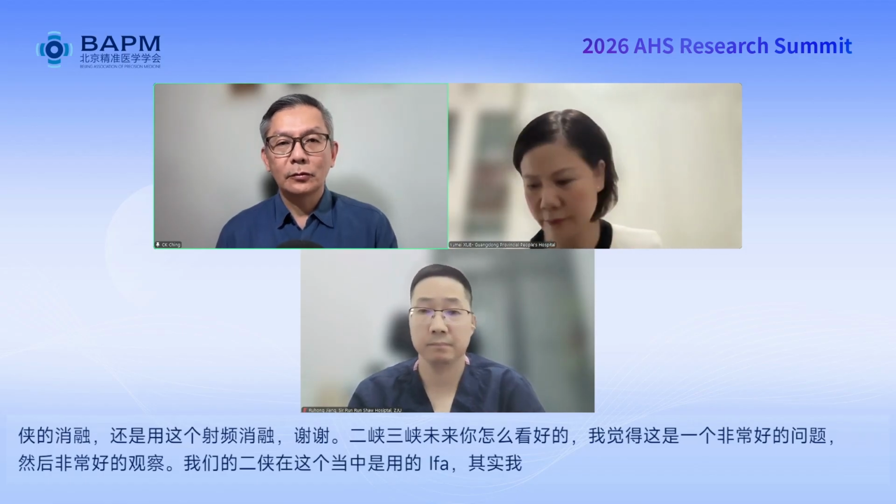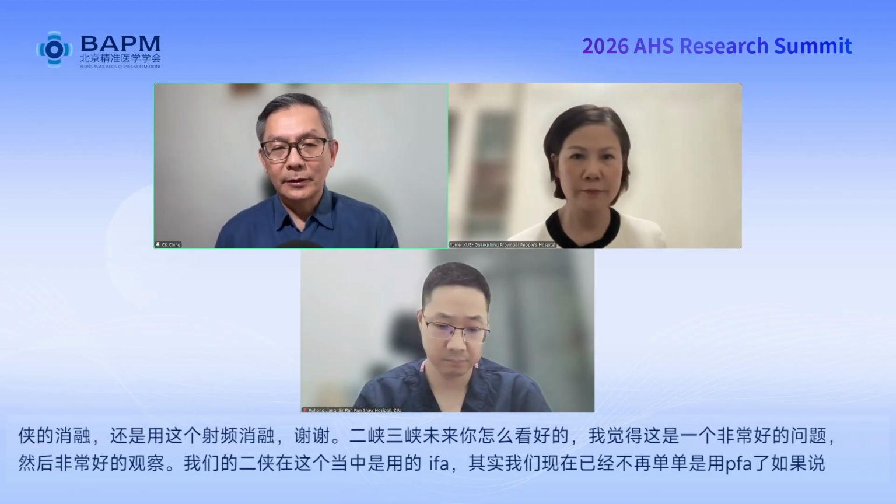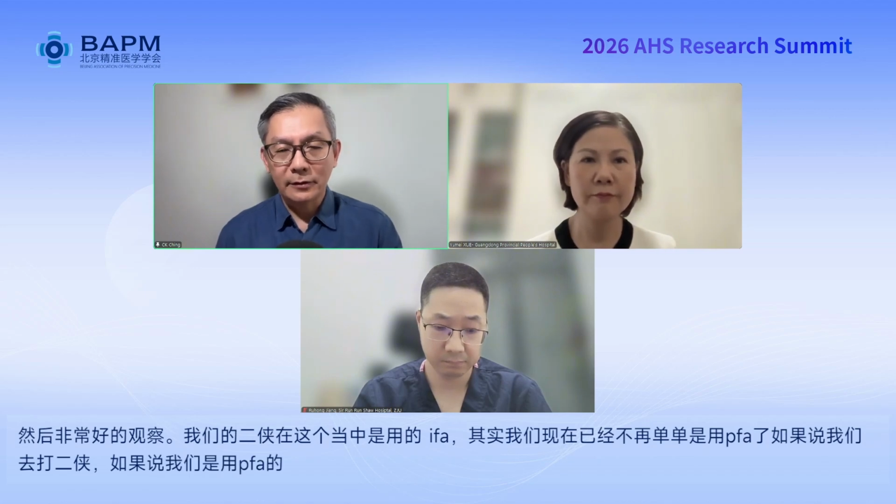We initially used PFA for mitral isthmus ablation. With the data that we have, we no longer just use PFA currently. If we were to ablate the mitral isthmus, and if we do use pulse field ablation, we would do additional ablation with radio frequency as of now, for reasons as stipulated by you.